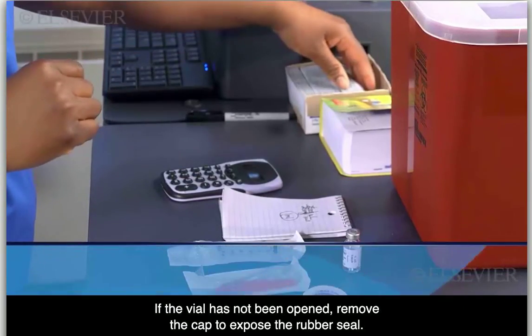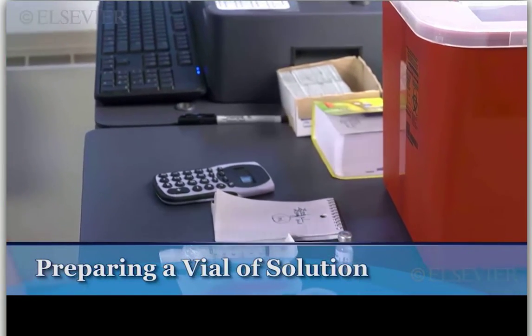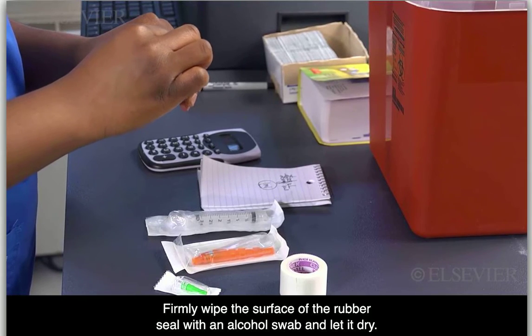If the vial has not been opened, remove the cap to expose the rubber seal. Firmly wipe the surface of the rubber seal with an alcohol swab and let it dry.